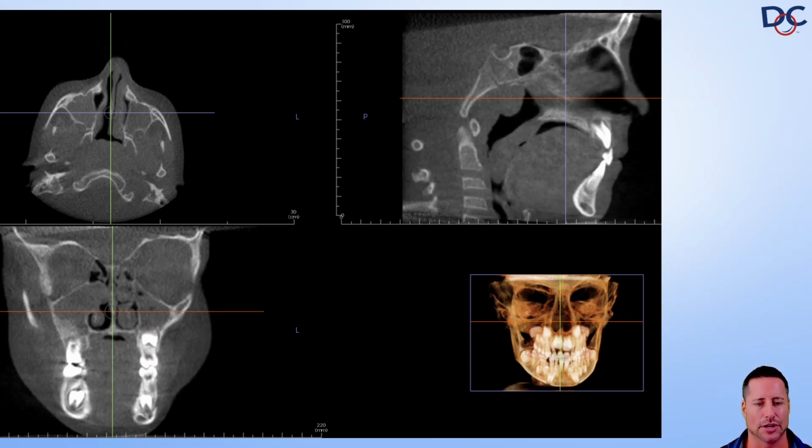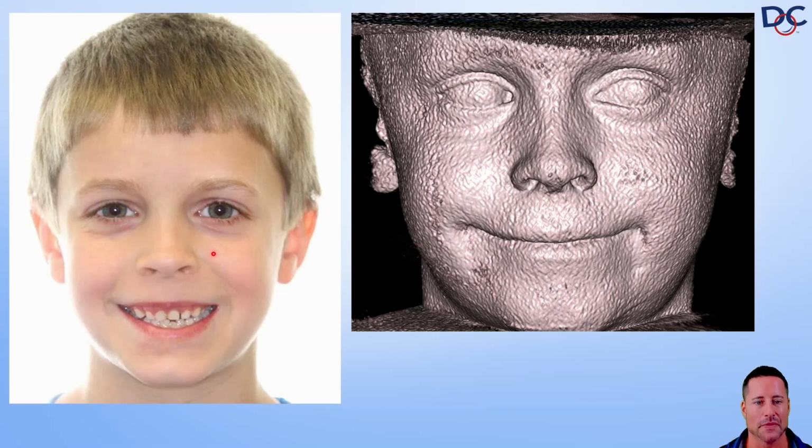Now, I know it looks kind of like he has an asymmetry. His head was just a little turned in the machine. This is actually him here. And this is just something I show them a lot of times. I put it up just to show you that there's not an asymmetry facially. But this is also cool. When you show this to patients, they love it. I mean, it looks like they're at a super high-tech office if they're investing in this technology. They just love seeing this stuff, and it fascinates them.